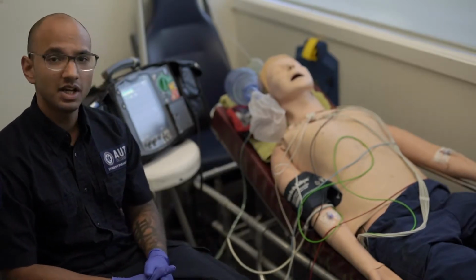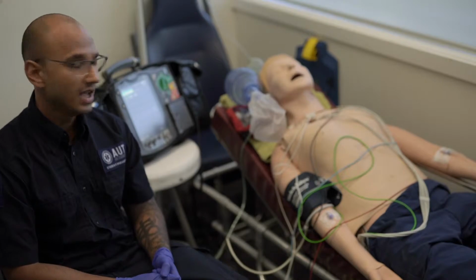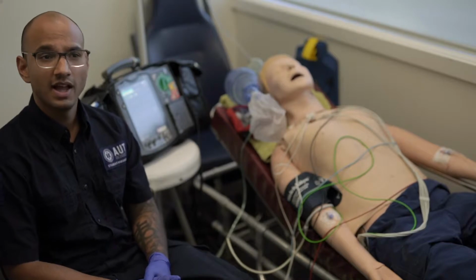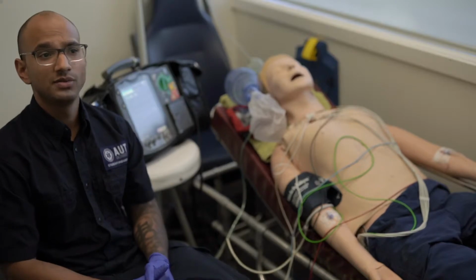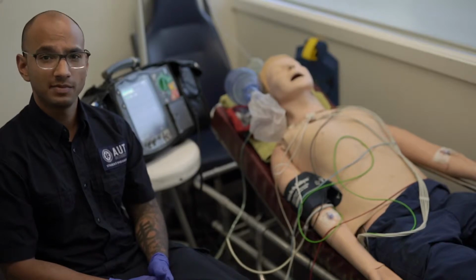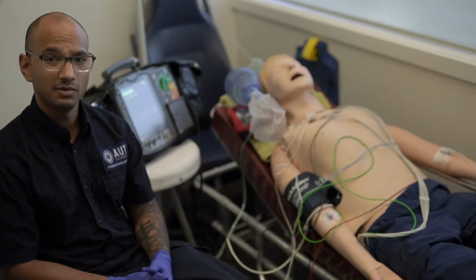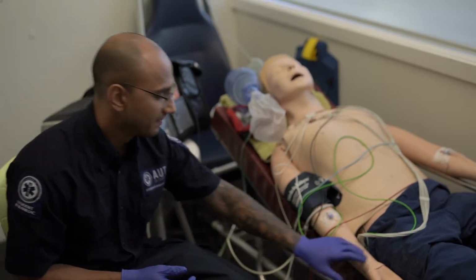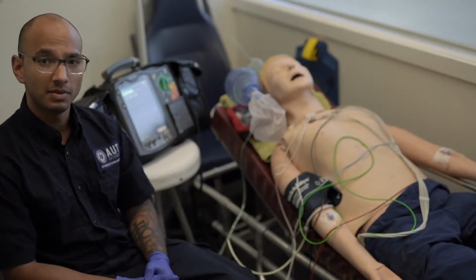Upon finding his vital signs, we have noticed that he's got a blood pressure of 70/40, a heart rate of approximately 170 beats per minute, an oxygen saturation of 94%, a blood glucose of 7.6, a temperature of 37.0, and a respiratory rate of 24. His GCS is 9, which is made up of 2, 2, and 5 for the motor score. He is unable to obey any commands and appears to be severely compromised.